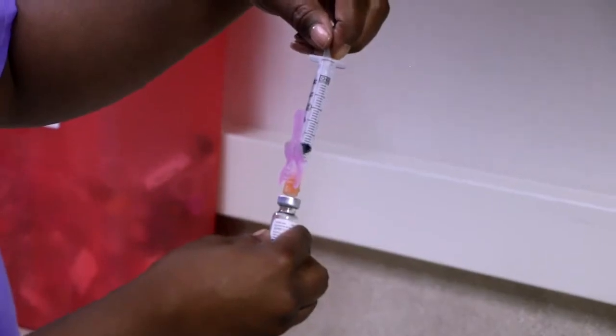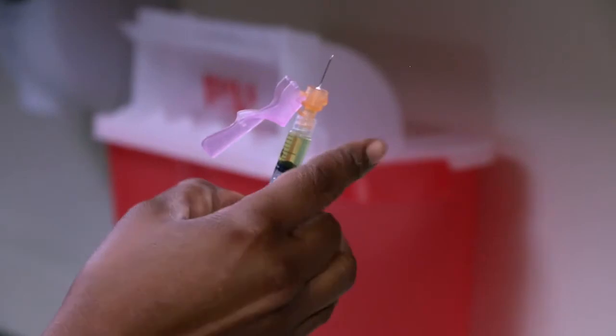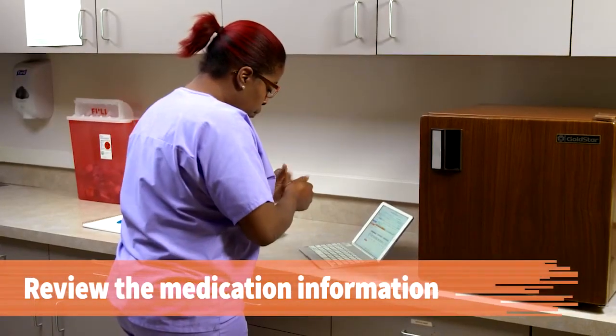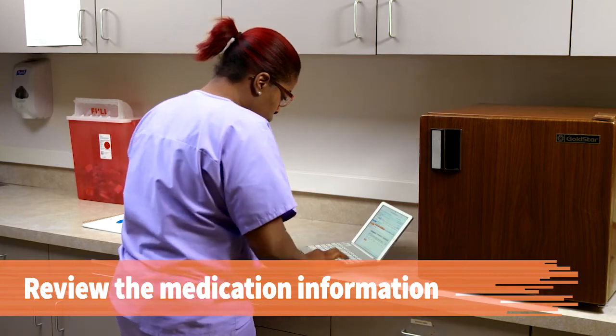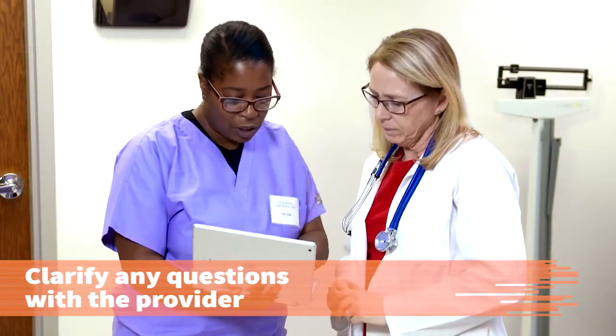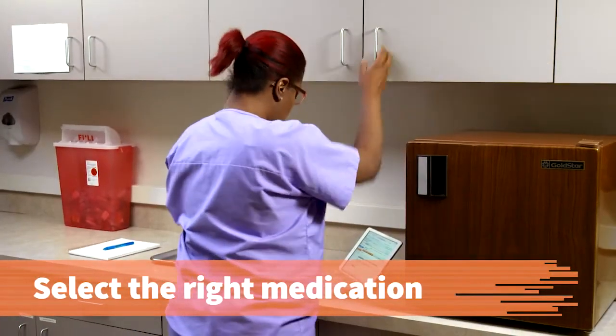In this procedure, you will learn how to reconstitute powdered medication and prepare a dose of medication for the patient. Using the drug reference information and the provider's order, review the information on the medication. Clarify any questions you have with the provider. Select the right medication from the storage area.